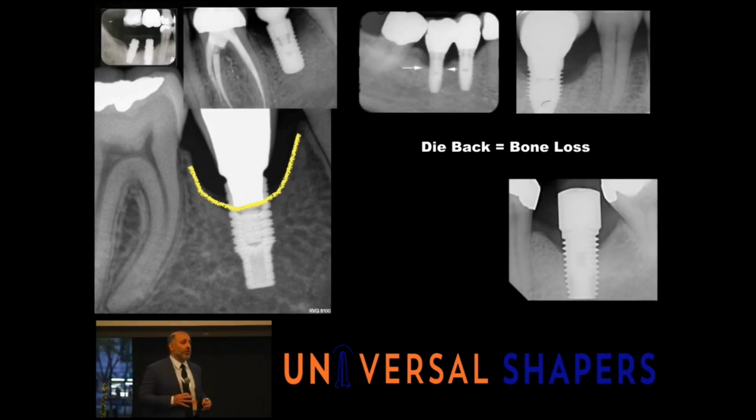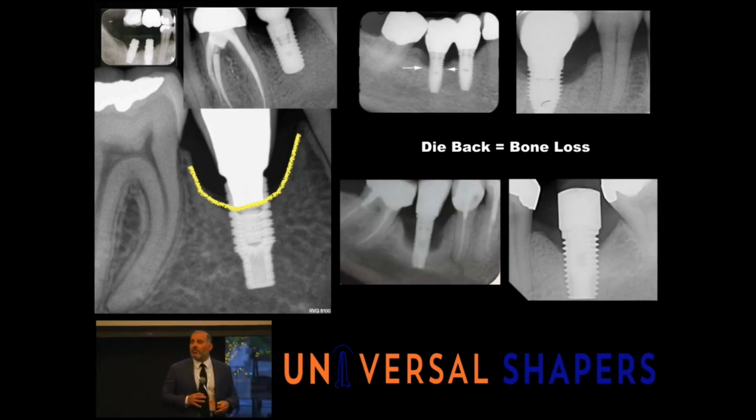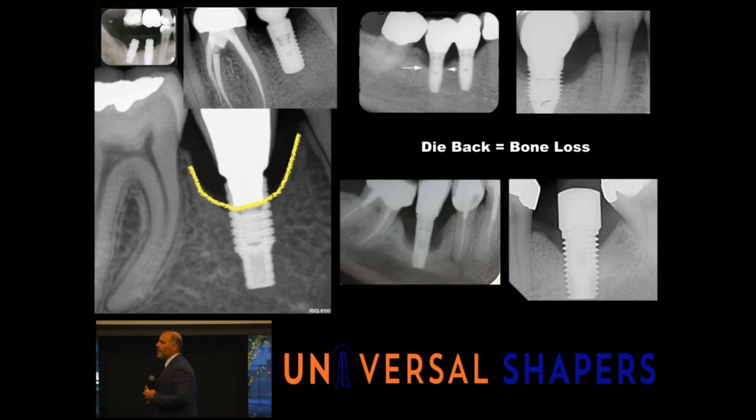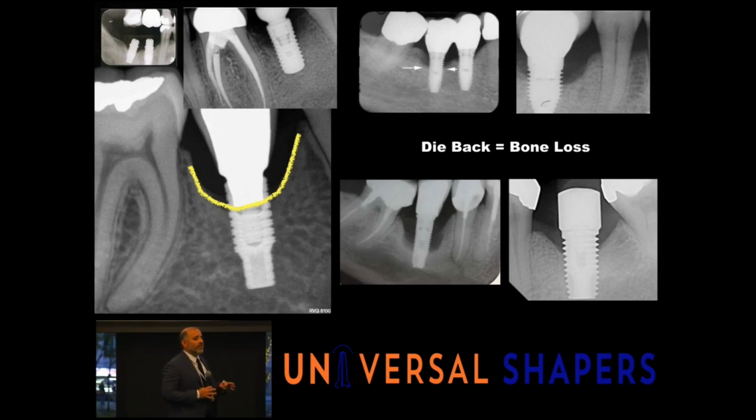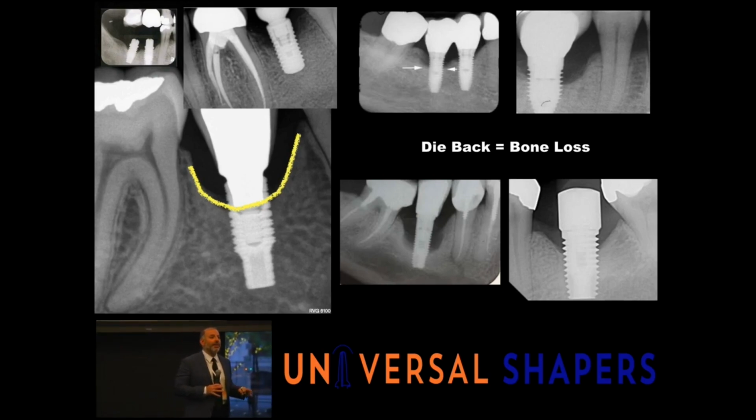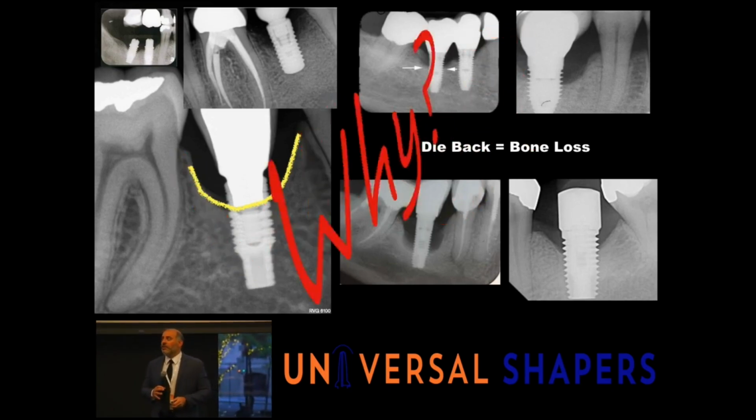And then we have to do a surgery. Sometimes we have to remove the implant. Sometimes we can try to preserve the implant, de-thread it. If it's not too bad, keep it, maybe put some bone graft or some soft tissue graft around it, and try to repair. We call it revision surgeries. Why? Because nothing's a failure, right? Nothing's ever a failure. Everything is a revision. If it didn't work the first time, we're revising it. We're changing the plan. So the word failure has kind of been eliminated over the years, more and more from the actual vernacular in implant dentistry. And we use these affectionate terms, dieback, revision surgery. And this is what's been happening over the last several decades.